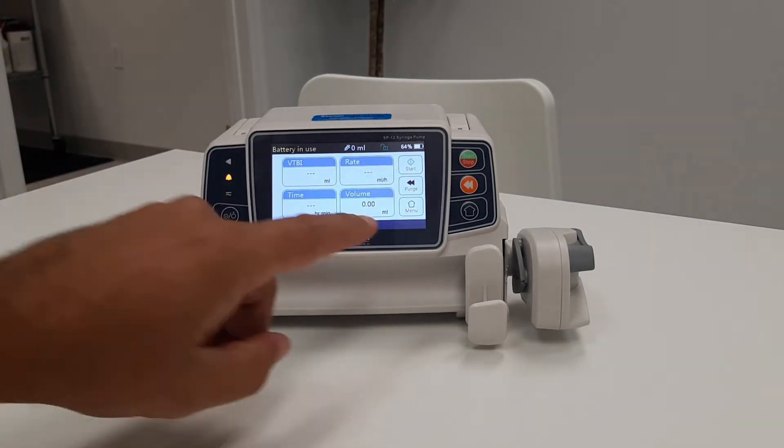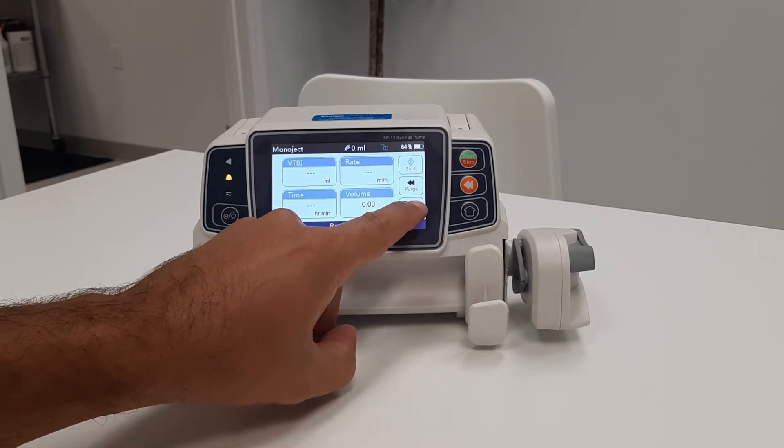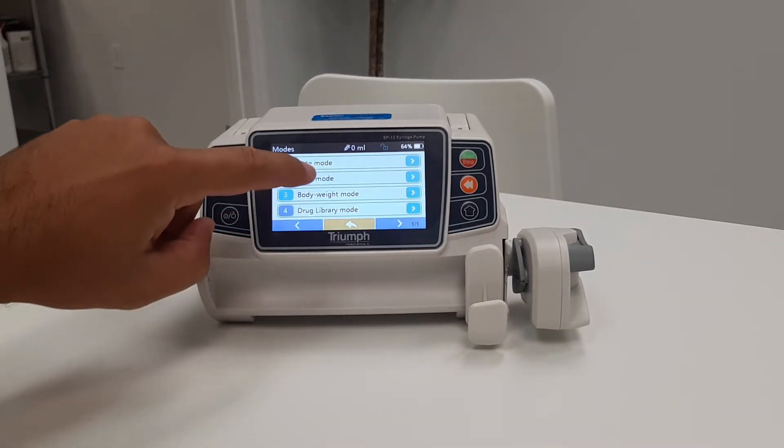The other way is by pressing one of the two menu buttons, selecting modes, and choosing your preferred mode.